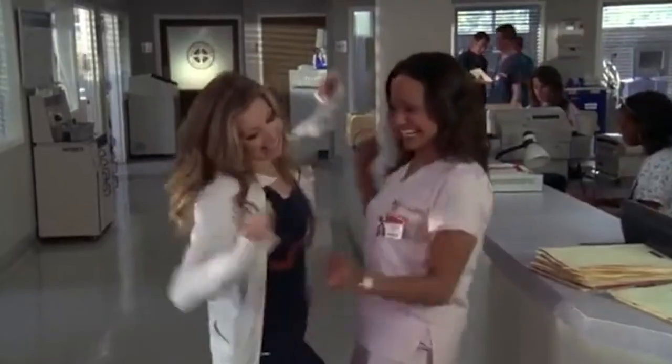Hey everybody, this is Dr. Packard. I'm in the office today taking care of some patients.